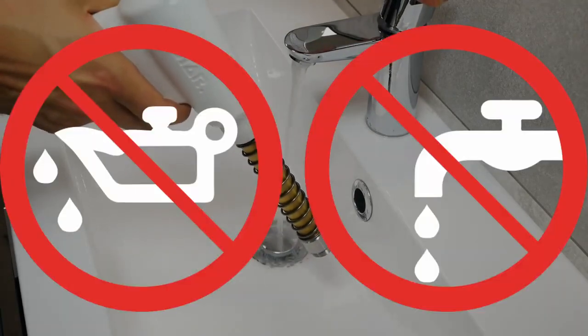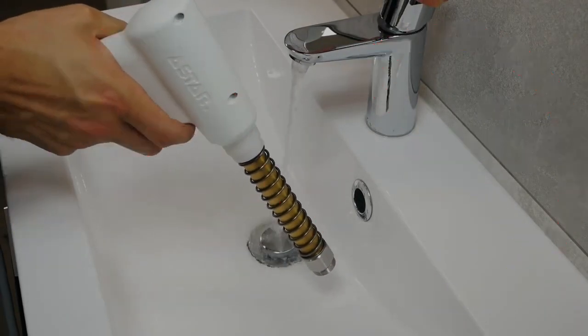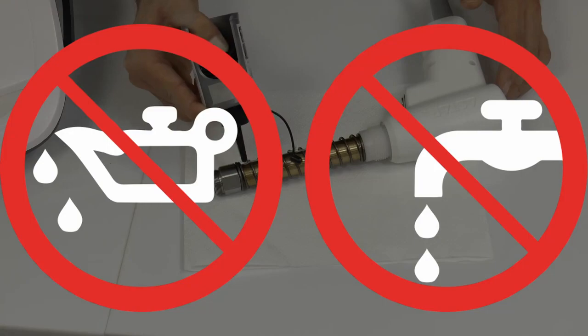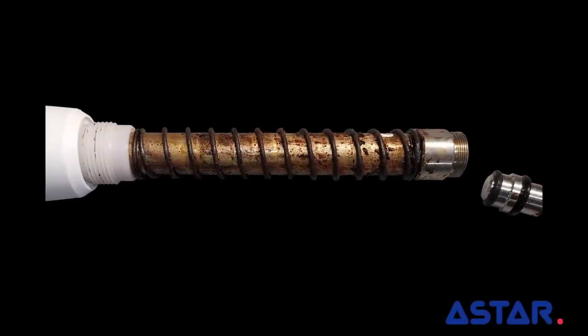Under no circumstances should you wash the projectile system or apply any lubricants on the surface of the system or inside it. This might damage the projectile system and the entire applicator.